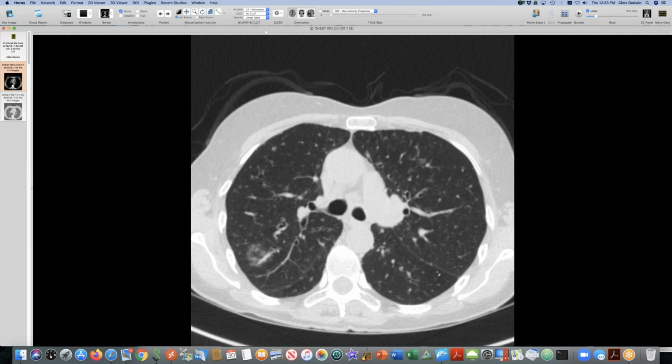I know there was a case last week where GLILD was the presumed diagnosis. I think this is our case. The recent case here that also fits with GLILD. Okay. And this one, David, in the context of CVID with hypogammaglobulinemia, presumably.